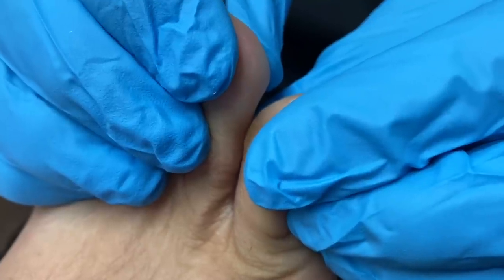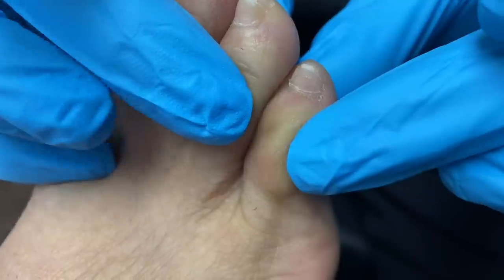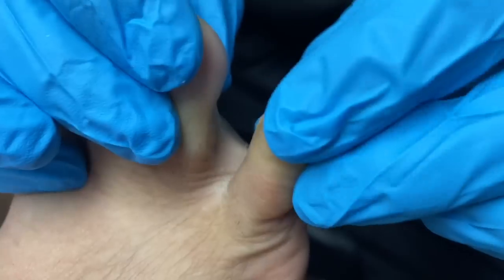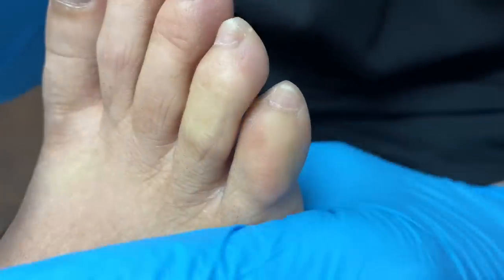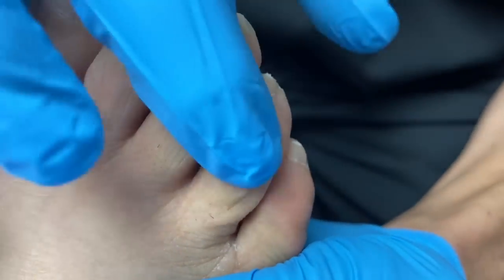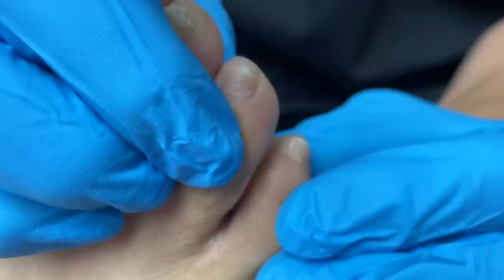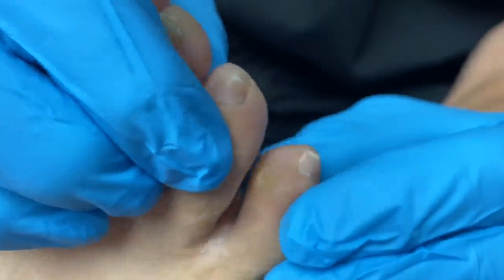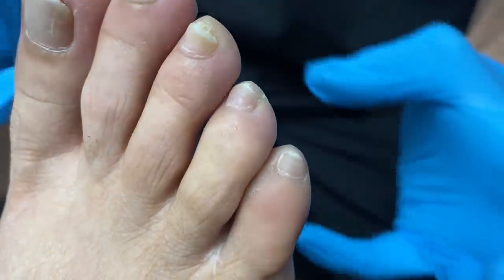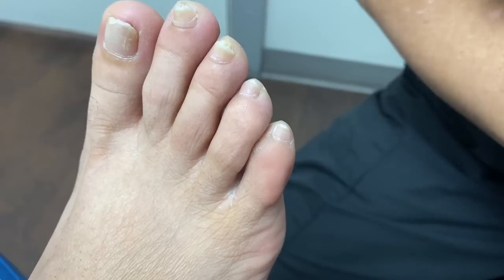Look at how, when the patient walks, that's where it lands — right there. So the patient is walking and this toe is hitting the bone spur. Bone on bone equals callus. So what we're going to go ahead and do is enucleate.